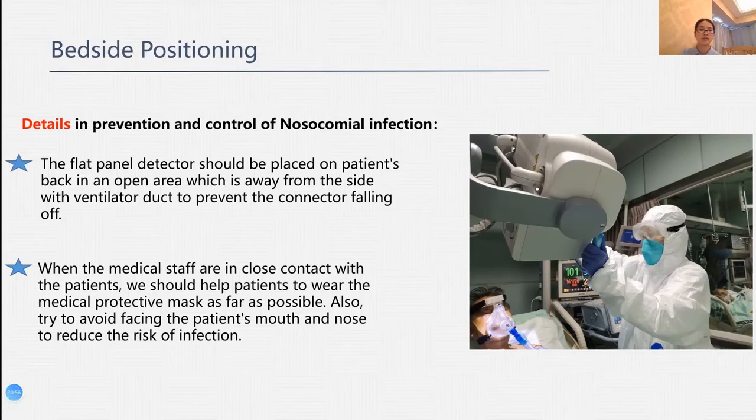And the last one is when the medical staff are in close contact with the patients, we should help patients to wear the medical protective masks as far as possible. Also, try to avoid facing the patient's mouth and nose to reduce the risk of infection.